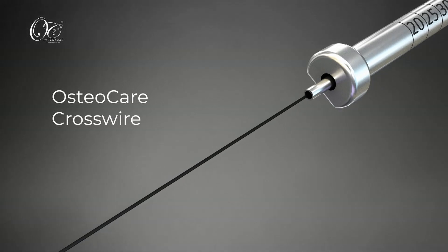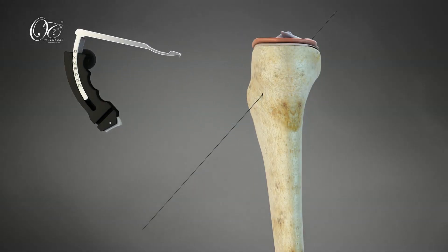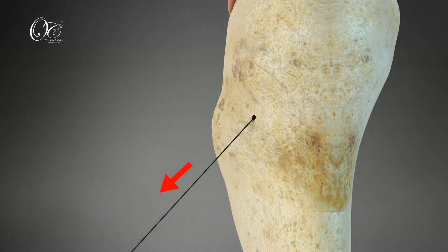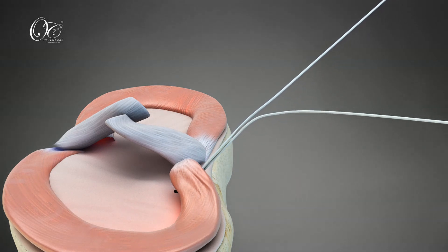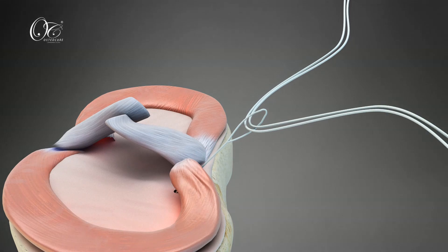The cannulated sleeve is placed for the OsteoCare Crosswire. Pass the loop and fiber through the suture shuttle devices, then pass the introducer fiber through the tibial tunnel.